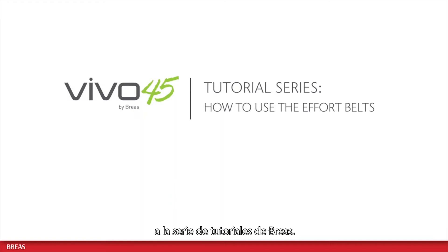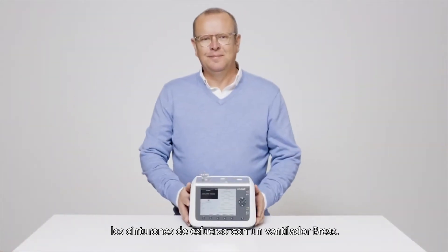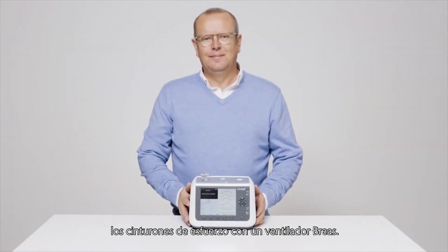Hello and welcome to the BreaS tutorial series. In this video I will show you how to connect and use the effort belts with the BreaS ventilator.